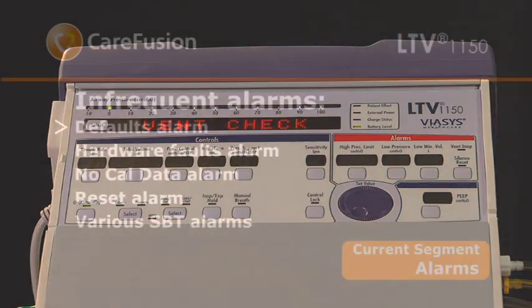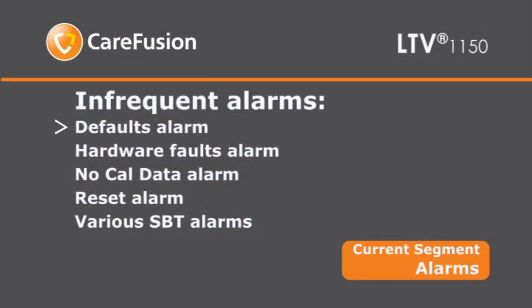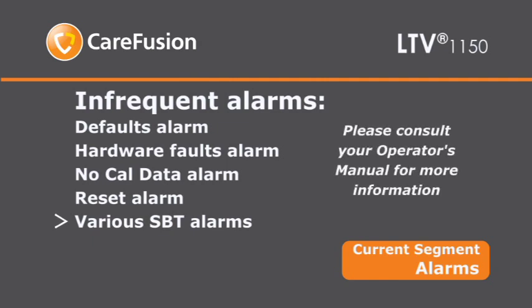The following alarms occur infrequently: the defaults alarm, hardware faults alarm, no CAL data alarm and reset alarm, and the various SBT alarms. Please consult your operator's manual for more information.